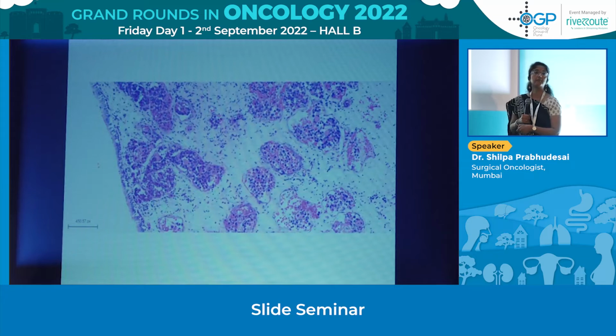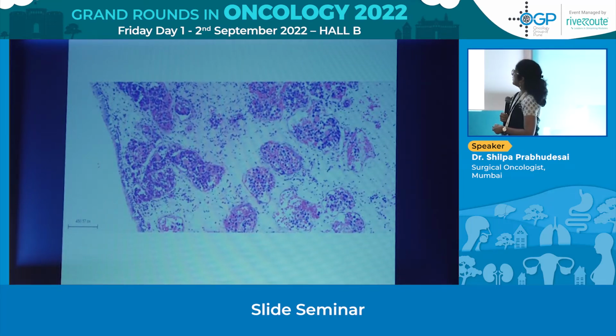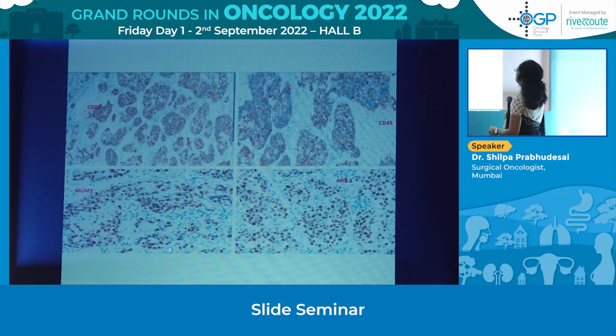Any thoughts from people who are sitting behind? Okay, so it didn't look like a carcinoma. What it did look like was a lymphoma, and everything is limited to these spaces. There is evidence of hemorrhage. There are places where you could see fibrin thrombi. Again, large cells in capillary walls, fibrin thrombi, and this was the immunohistochemistry.